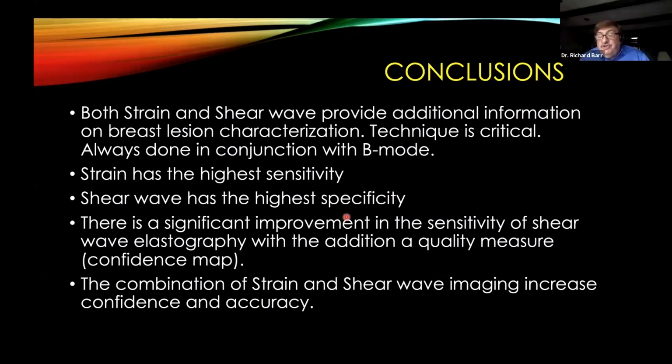Yes, so we never do point shear wave in breast. And the reason is that, in fact, we don't do it in any focal lesion because cancers are very heterogeneous in stiffness. Some areas are very stiff. Some areas may be very soft because of necrosis. When you do point shear wave, you don't know where to take your measurement. So unless you're going to take many, many measurements over the whole area to find the stiffest area, which is very difficult to do, you're going to get poor results.